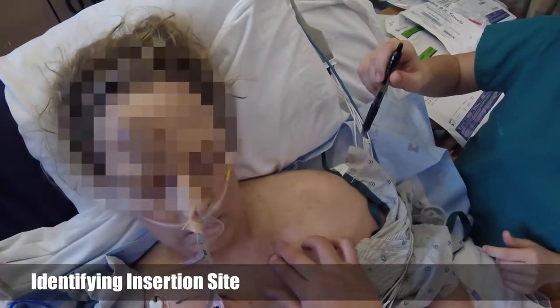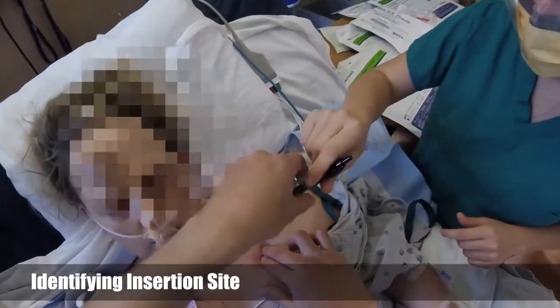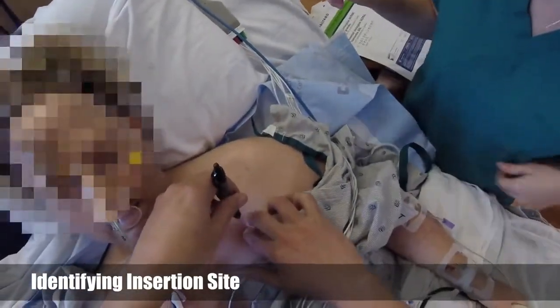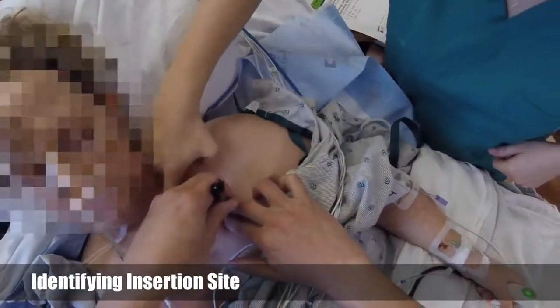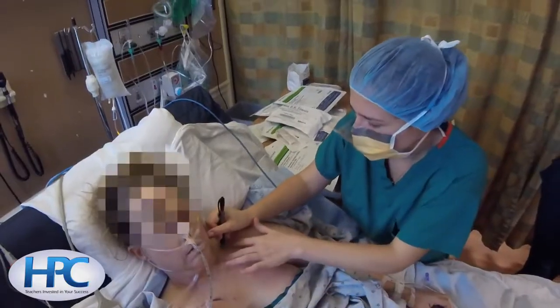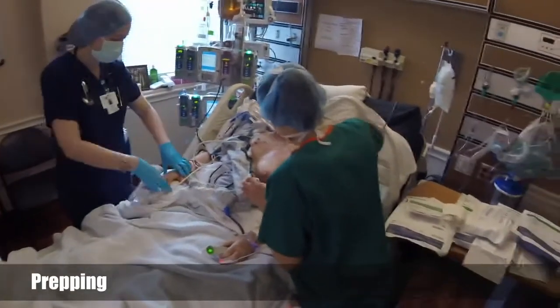Here we're identifying the spot along the anterior chest wall in the midclavicular line just above the third rib, where we're going to perform the insertion of the pigtail catheter. We're identifying that with the tip of a ballpoint pen. During the timeout procedure, we put our initials.